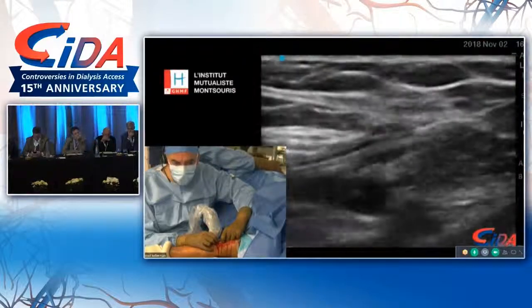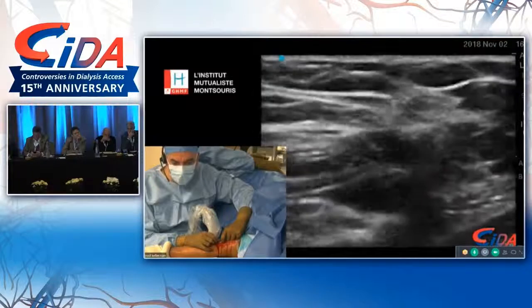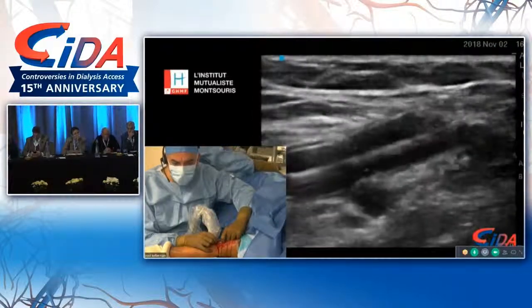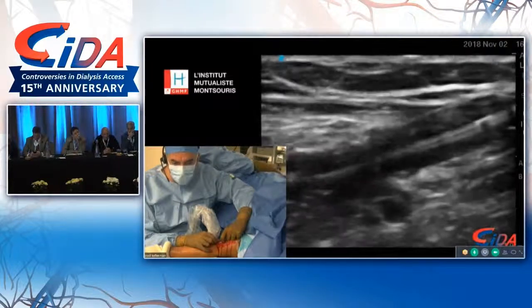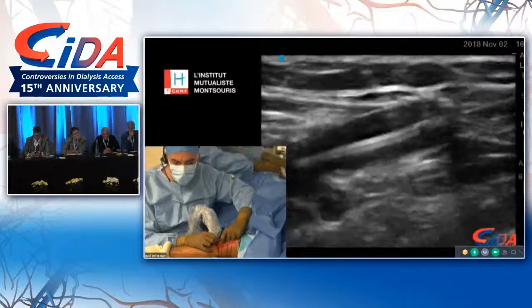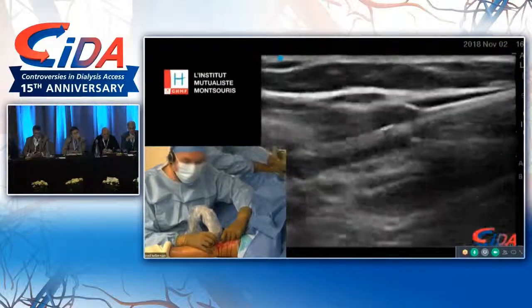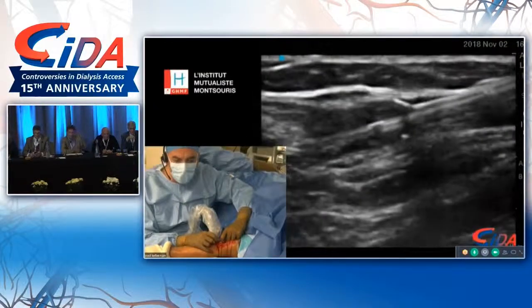And I'm going to inflate, without some specific science or evidence behind it. I'm going to inflate a few times, give it a few inflations until I feel comfortable about the final image I'm getting. And I'm feeling pretty comfortable, to be honest, right now. Okay, deflate.